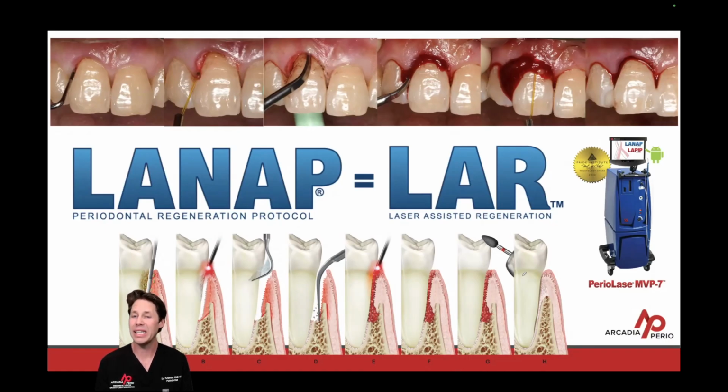In step D, we're going to do our blunt dissection bone biomodification. We want to make the bone bleed so we can get the body to release stem cells. In step E, we're going to change the laser setting to a hemostasis setting, so a longer pulse duration, to get that good gelatinous blood clot. In step F, we're going to thin out the blood clot with compression, usually wet fingered compression.